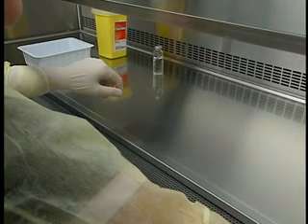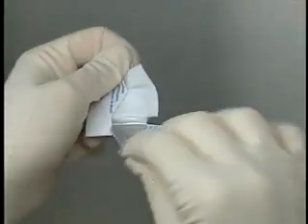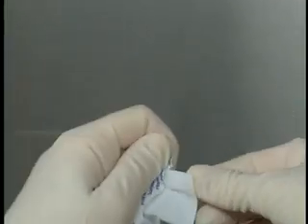Unwrap an alcohol swab or a sterile gauze and place it on the work surface, taking care not to contaminate its upper surface.